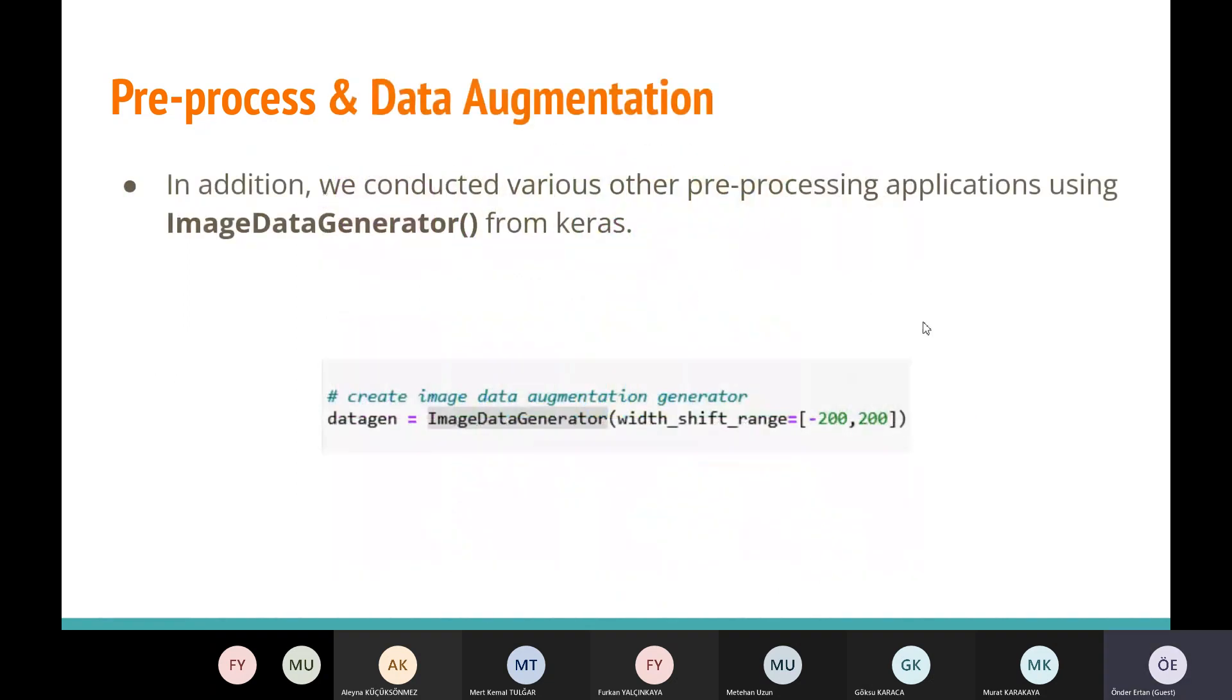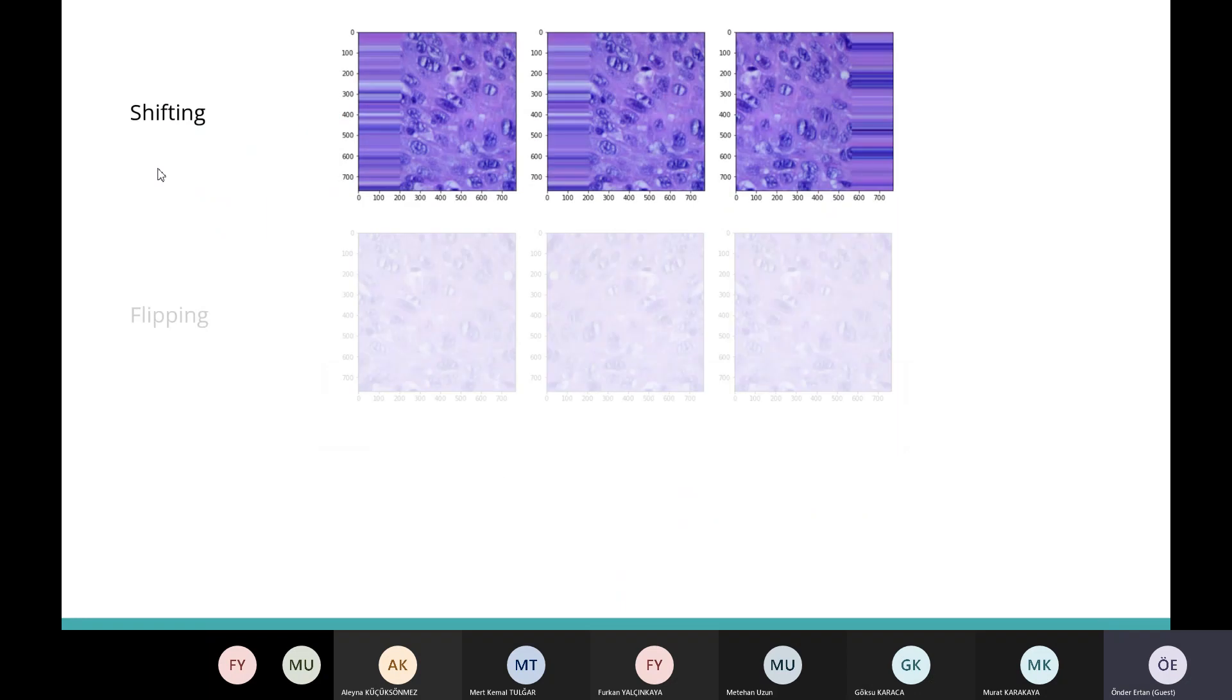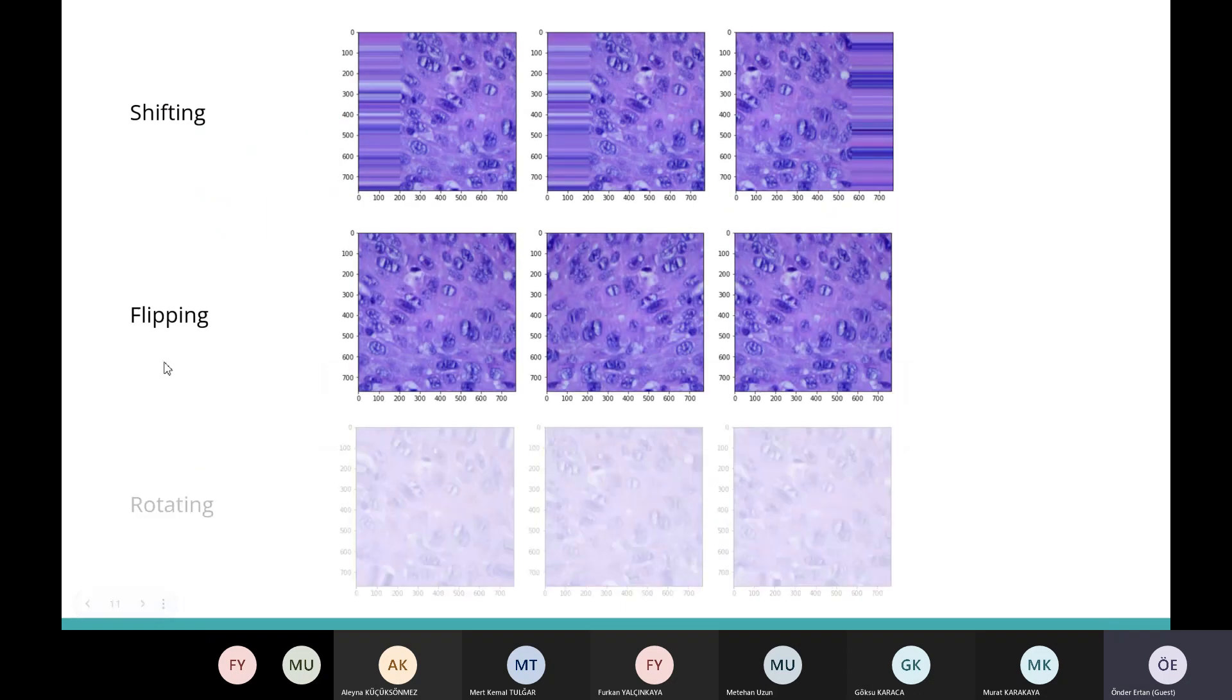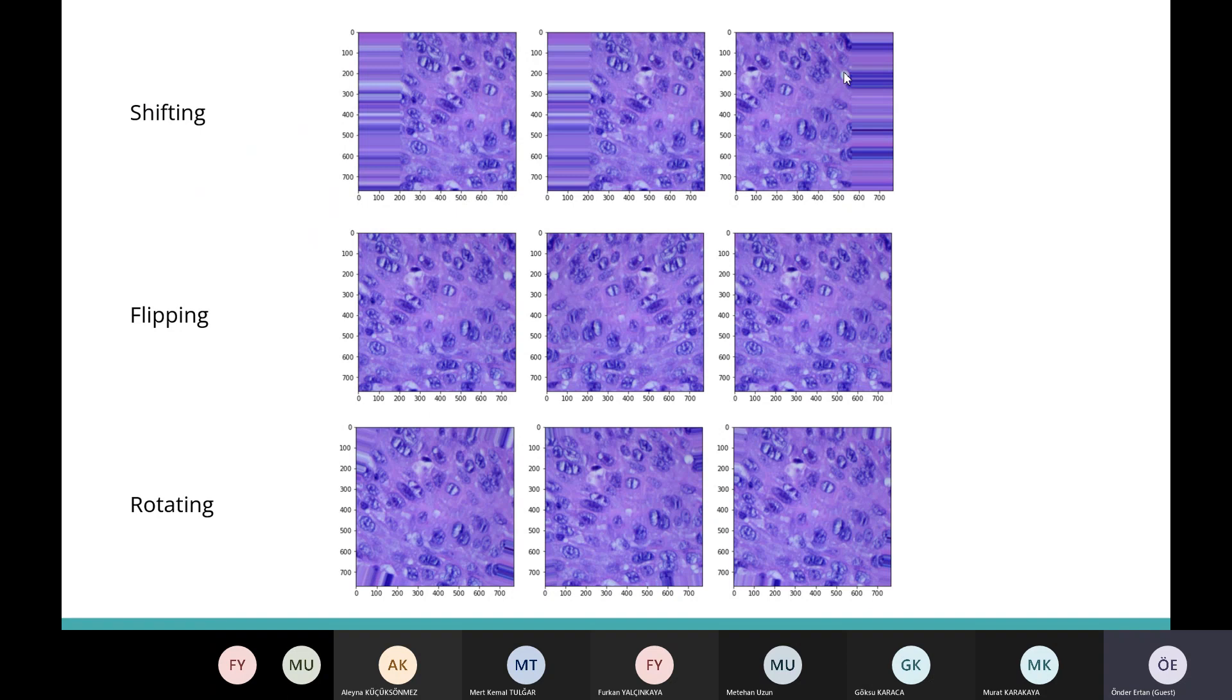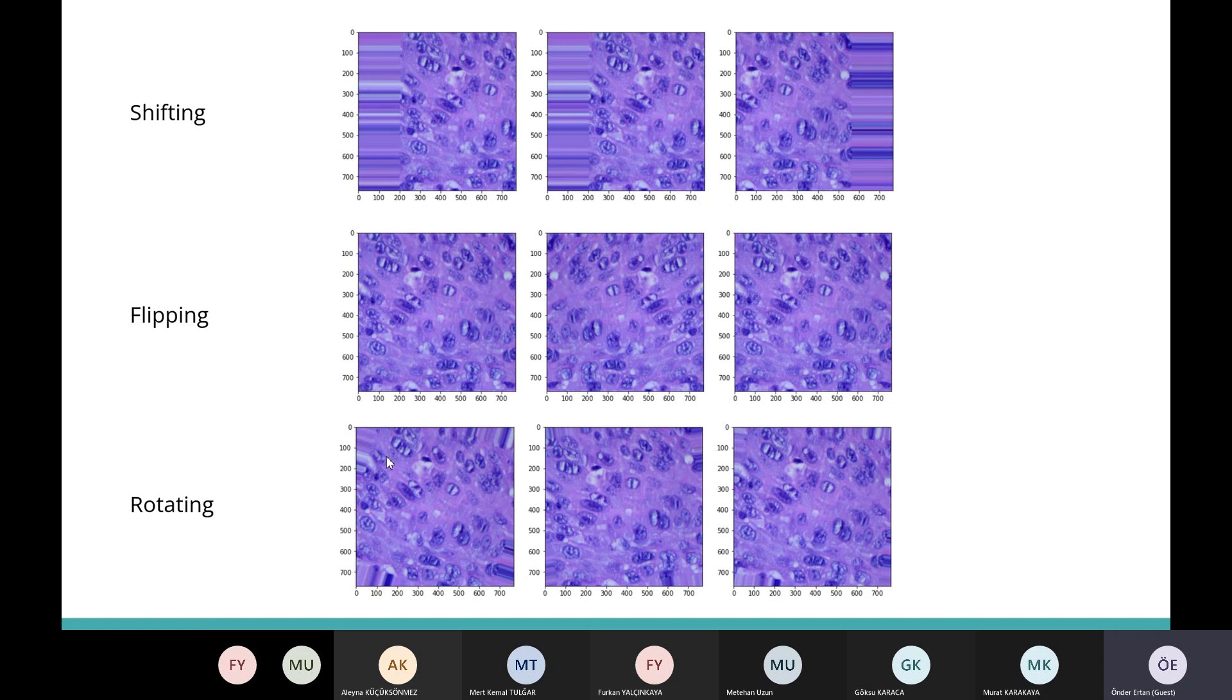Pre-process and data augmentation. In addition, we conducted various other pre-processing applications using image data generator parameters. We shifted our images, flipped them and rotated them. Here you can see the shifting process on a sample image of SCC class. In this one, they are flipped. You can see them here and rotated as you can see in these parts.